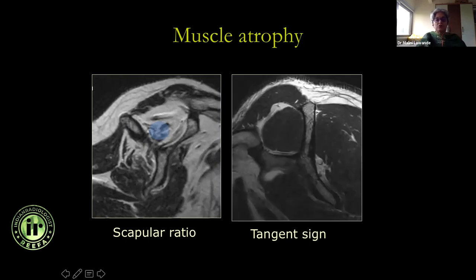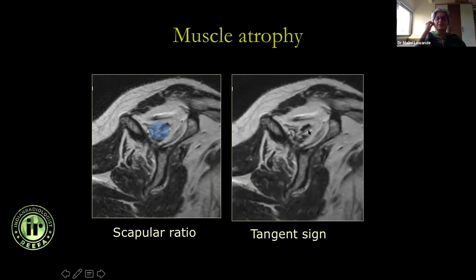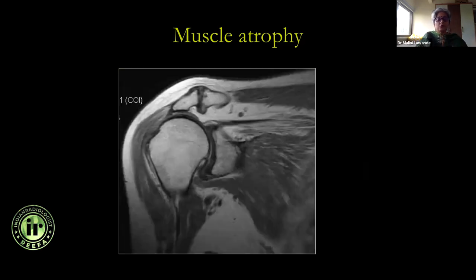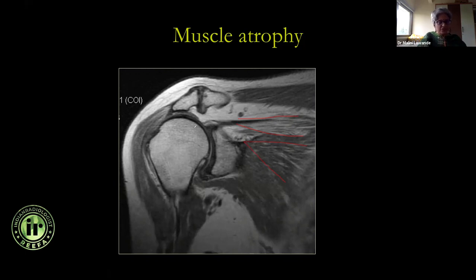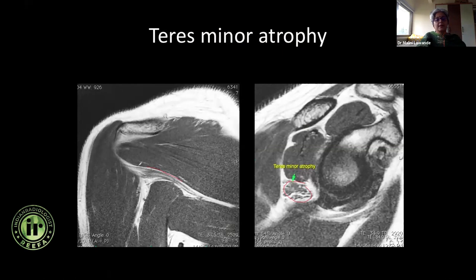There are two things: muscle volume loss, where the size is smaller but there is no fatty infiltration — with physiotherapy that can still be regained. If you draw a line along the coracoid process and the spine of the scapula, the supraspinatus should go above it. But once there is advanced fatty infiltration, that muscle is not going to recover no matter what. Remember the classifications — mild, moderate, severe — or use formal grading schemes based on how much muscle versus fat is present. Whenever there is rotator cuff muscle atrophy, consider either denervation or a tendon tear.